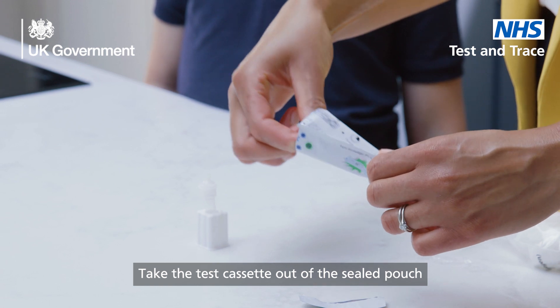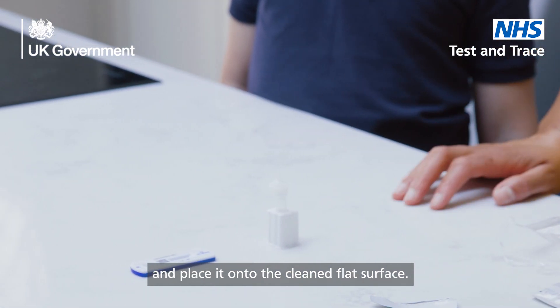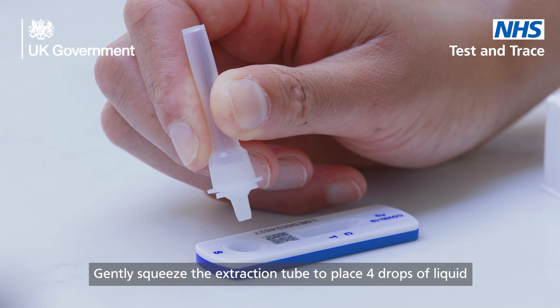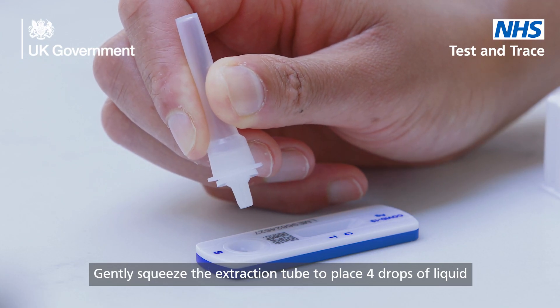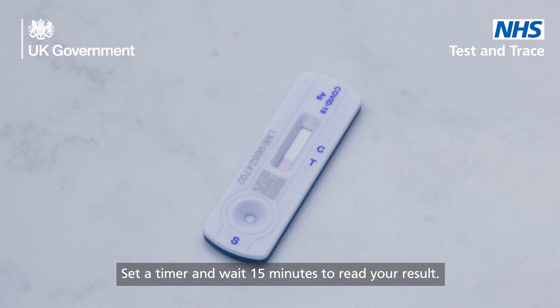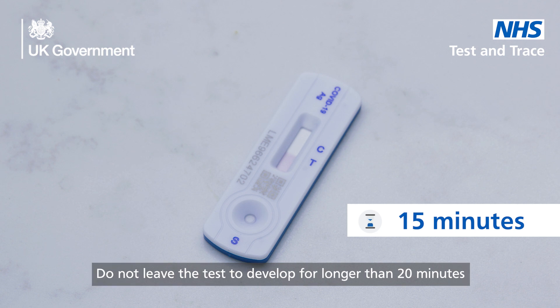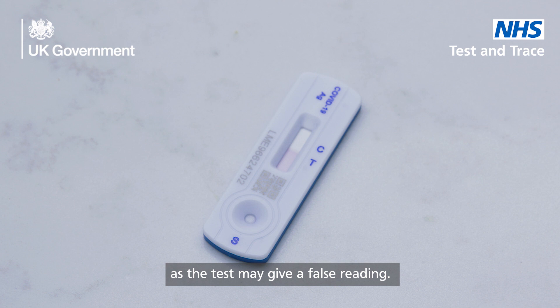Take the test cassette out of the sealed pouch and place it onto the cleaned flat surface. Gently squeeze the extraction tube to place four drops of the liquid onto the sample well on the test cassette. Set a timer and wait 15 minutes to read your results. Do not leave the test to develop for longer than 20 minutes as the test may give a false reading.